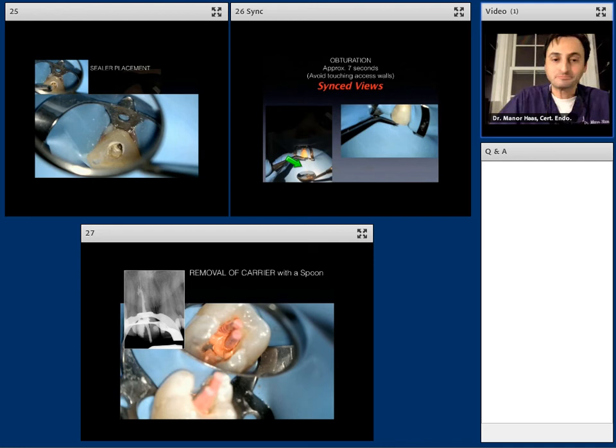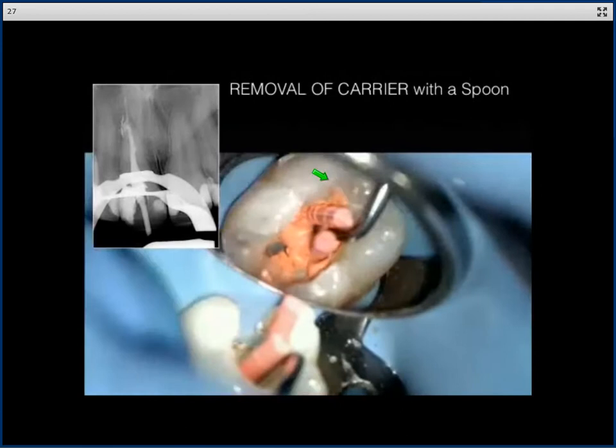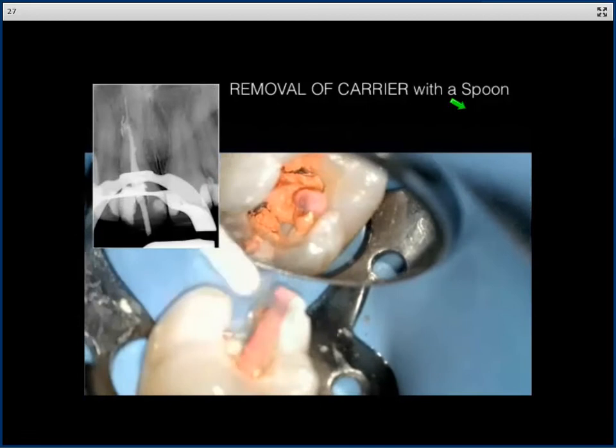And so it takes me to my next point, which is the frustration you'll see in this video on the bottom of how do you remove these carriers? Well, remember this over here. This pink thing is gutta percha. It's not plastic. Remember I said it's like ice and water? Well, the pink is the ice and the orange is the water. In other words, both are gutta percha.